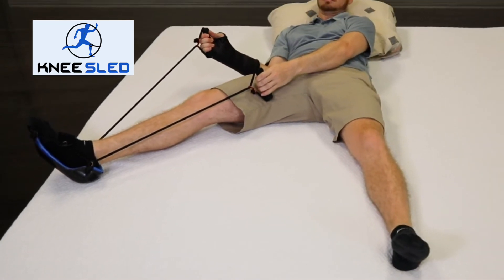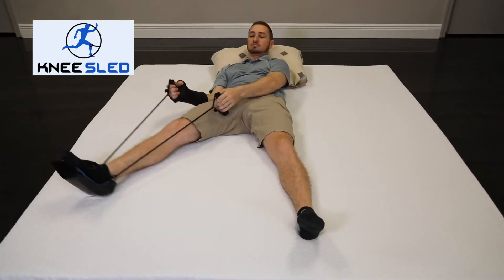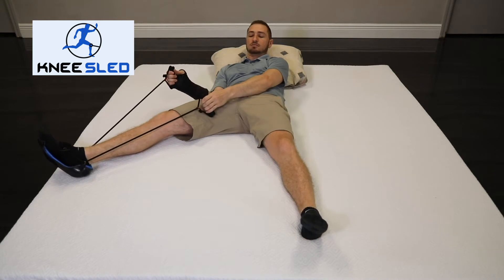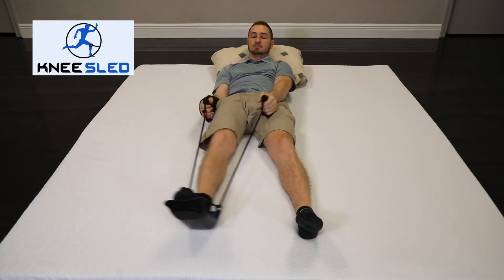Start laying flat with a pillow behind your head for comfort. Straighten your leg, then slowly begin to slide your leg out toward your side, keeping your heel on the bed.